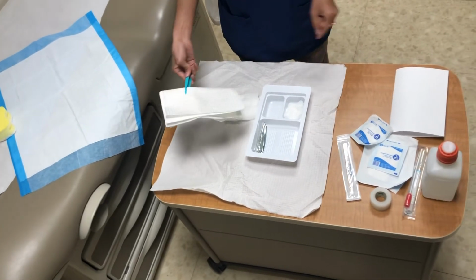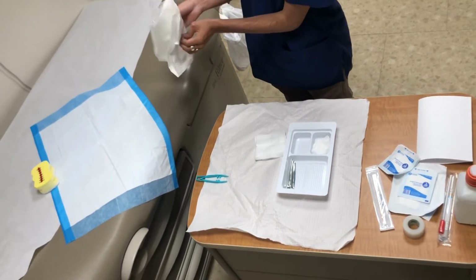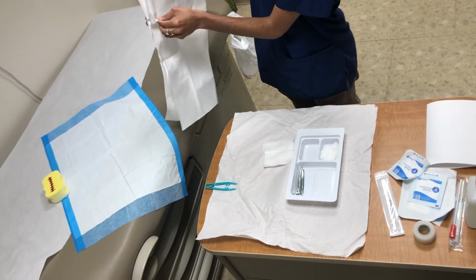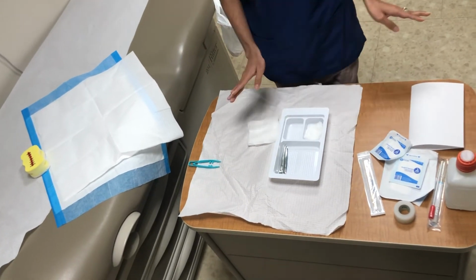And this is the shiny side, so it's okay for me to hold it. And I'm going to use that. This is a second sterile field, so I'm going to use it here and create another sterile field.